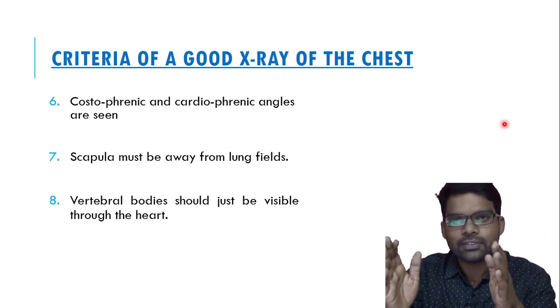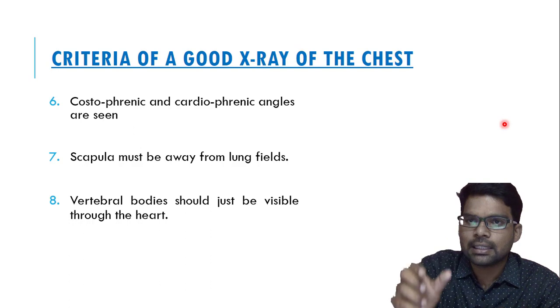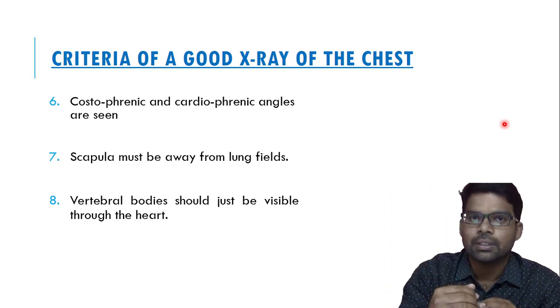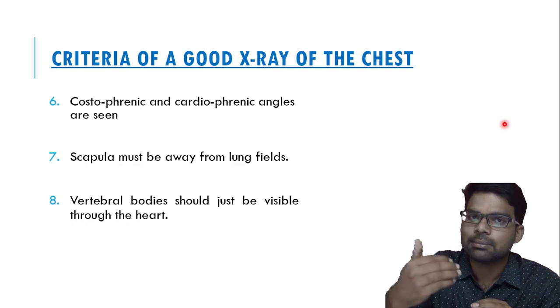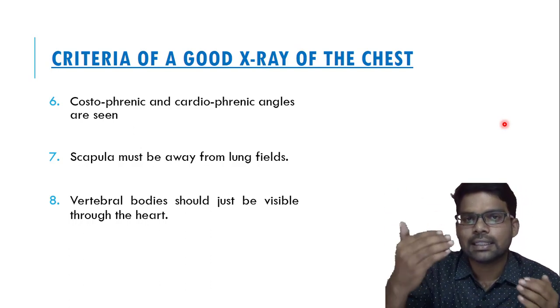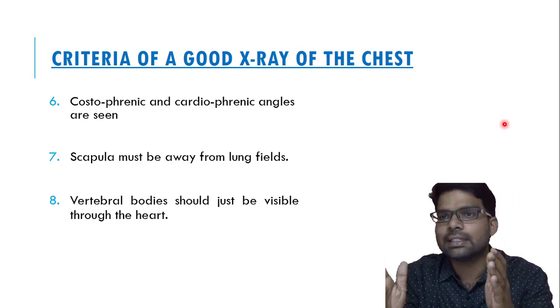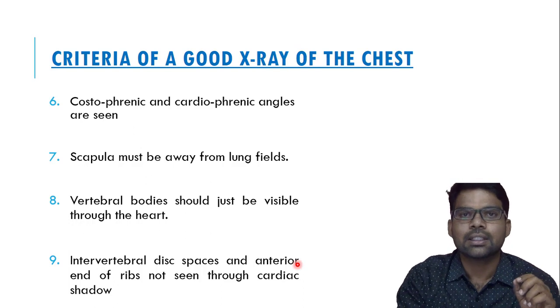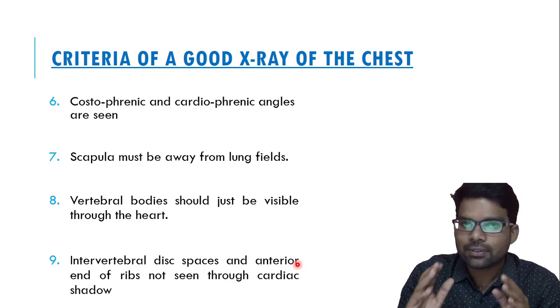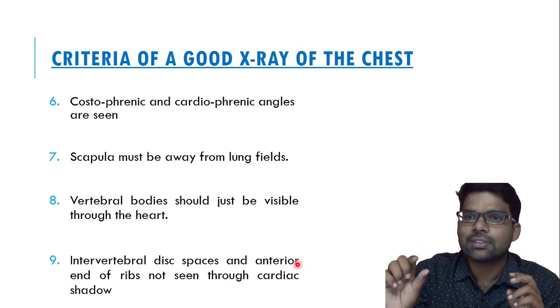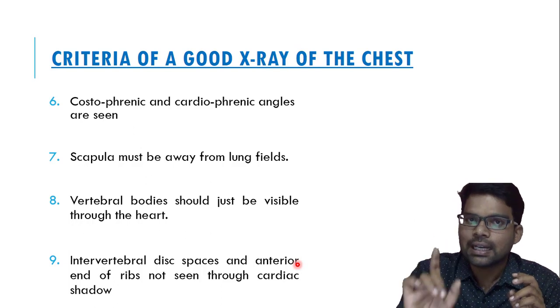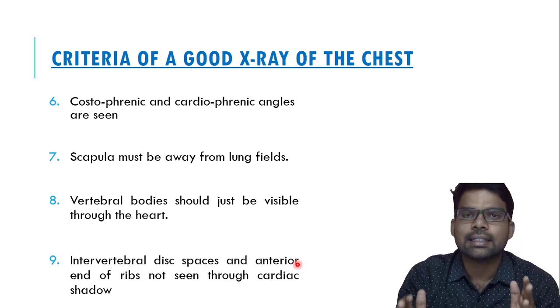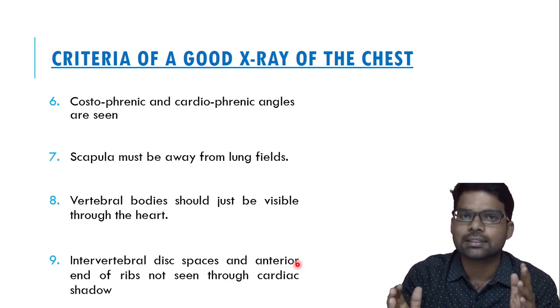The eighth point: vertebral bodies should be barely visible through the heart. If they are more visible, it implies over-exposure; if they are not visible, it is under-exposure. The ninth point: intervertebral disc spaces and anterior ends of the ribs should not be visible through the cardiac shadow. If they are visible, it implies over-exposure of the film. These nine points are the criteria for a good chest X-ray.